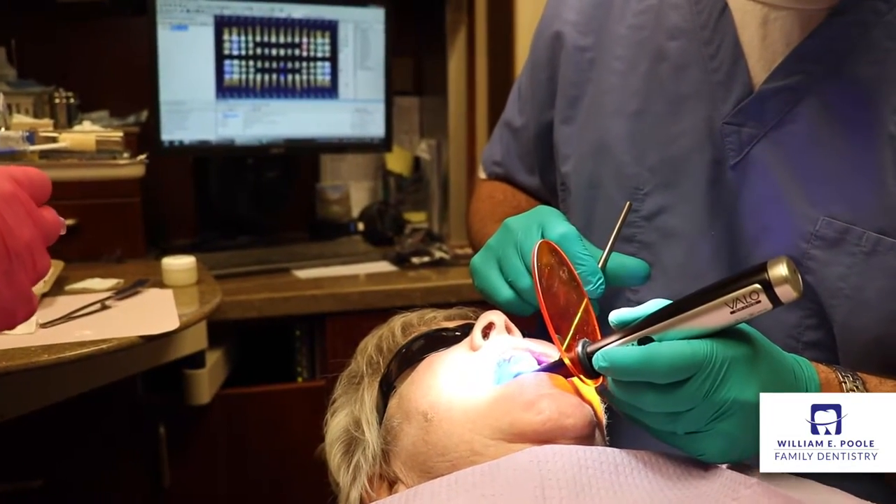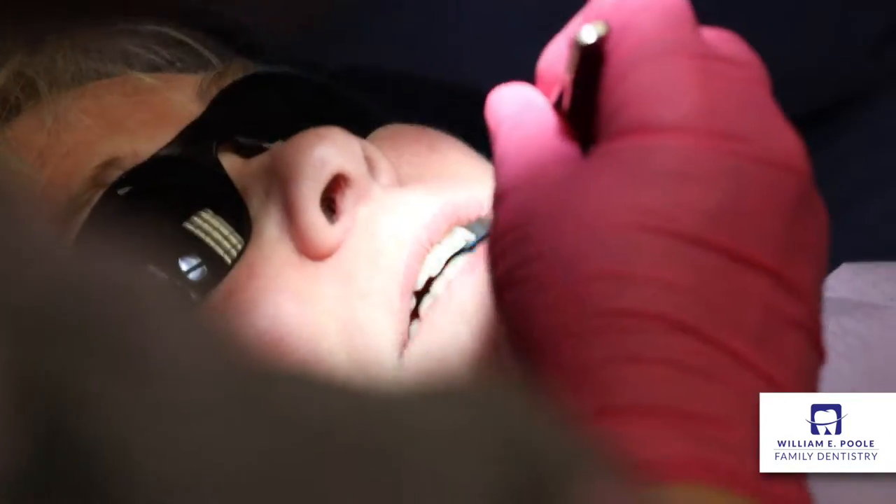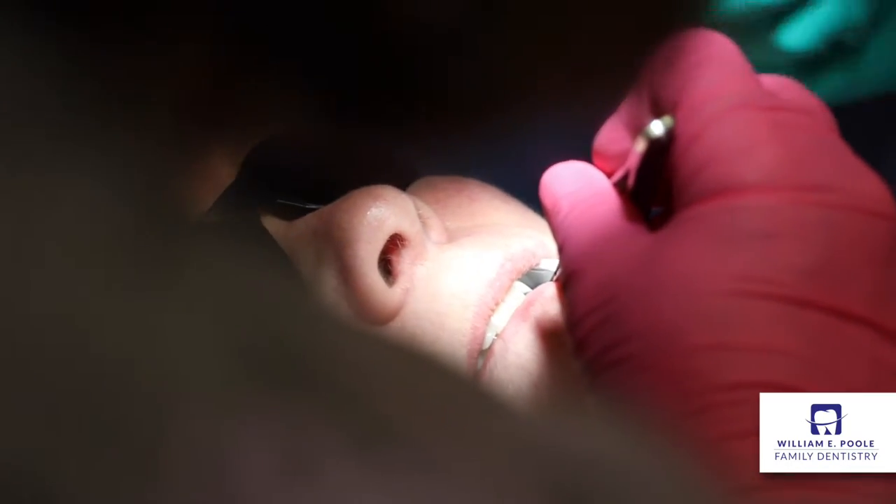After that, we fill the crown with bonding agent, which is a type of cement, and then we cement the crown onto the tooth.